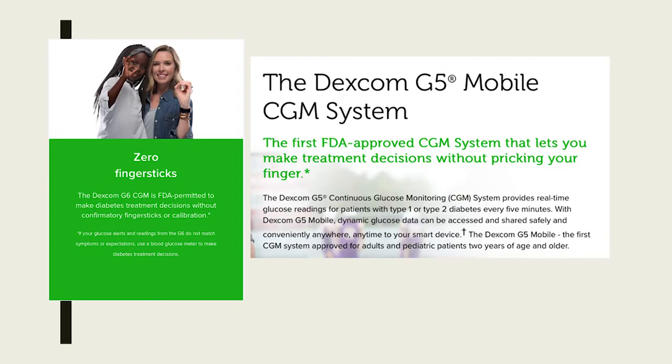So the G6 system does not require calibration. You put it on, and it goes through its 2-hour warm-up period. The traditional G5 required calibration to start. By calibration, I mean you had to check your blood sugar in the typical way using a blood glucose meter, and then input that blood sugar in order for it to start. That was how it calibrated, and it required that you do that every 12 hours.